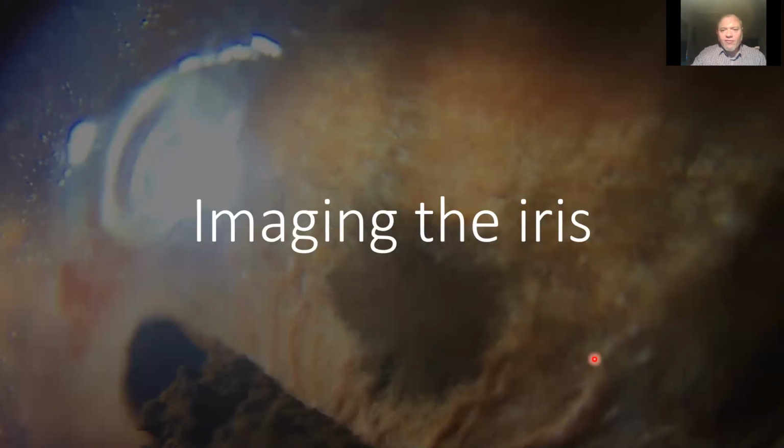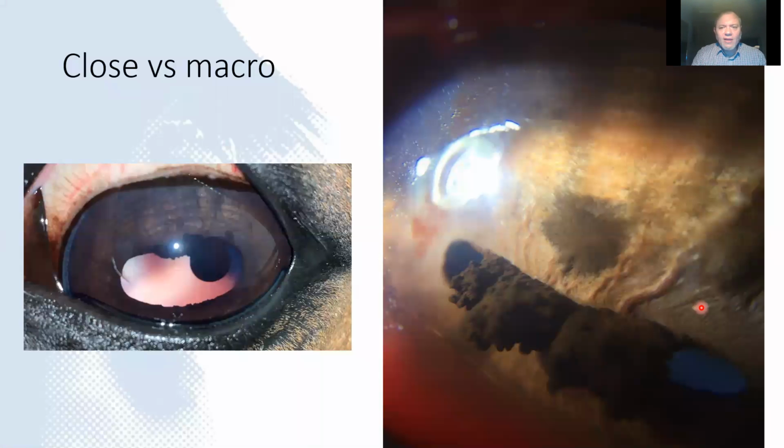Imaging the iris itself is a beautiful place to explore. It's like looking at the surface of the moon or one of the other planets. And there are different ways of looking at it. We can use a close-up view without any fancy lenses, just using digital zoom to get the eye to fill the whole screen.